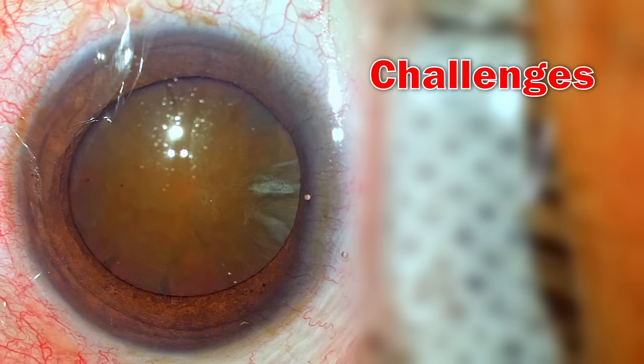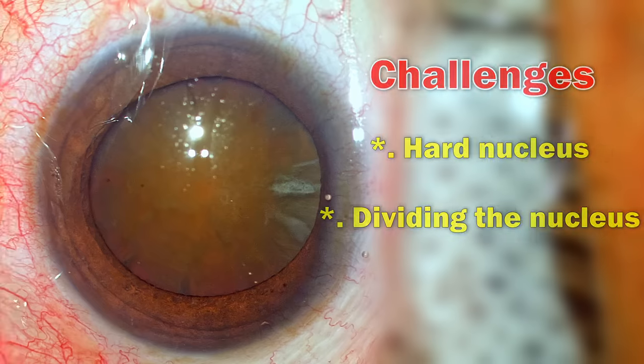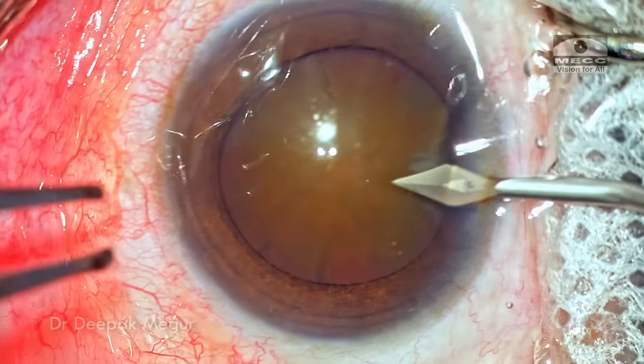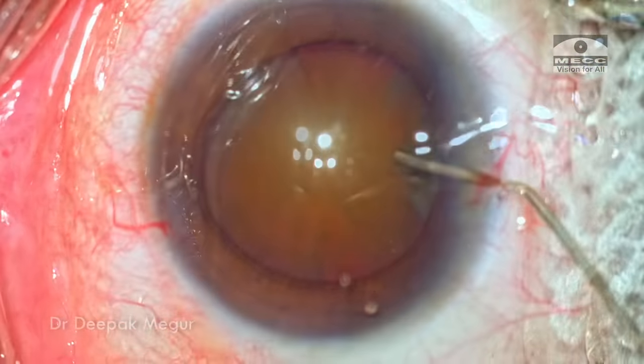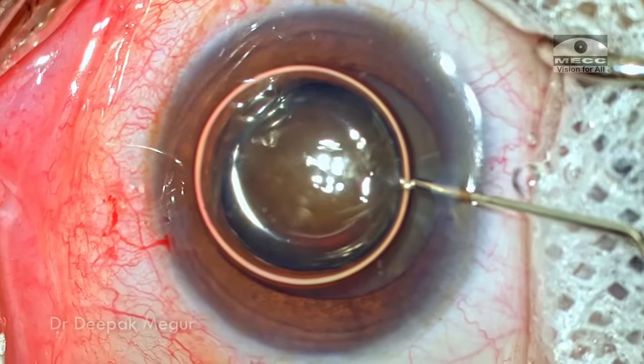The main challenge in this case is to deal with this hard nucleus — dividing it into smaller fragments is going to be a challenge. The good part is the cornea is extremely clear, visibility is not an issue, and the pupil is also very well dilated. So these are the encouraging factors.